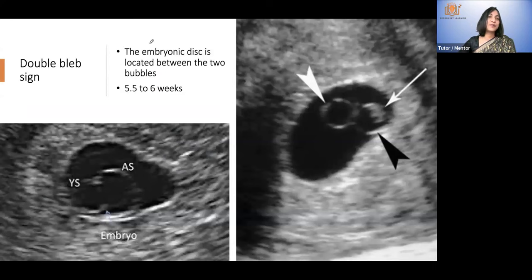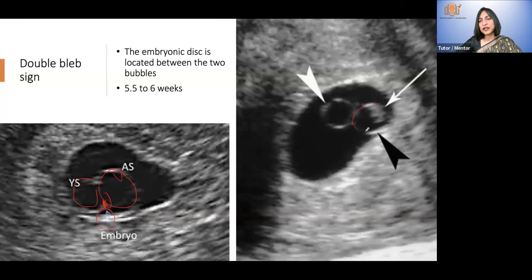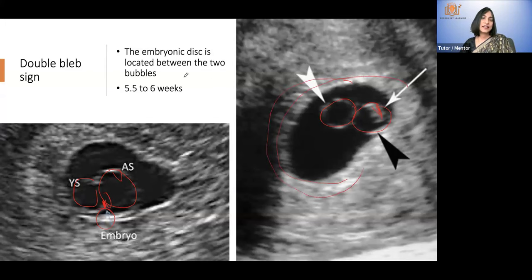What I want you to see is this double bleb sign. This is the yolk sac which appeared earlier and is still present, and there is an amniotic sac also. In this picture you see a small embryo — the embryo will not be present in the yolk sac; it has to be in the amniotic sac. In another clear picture: this is the amniotic sac, this is the yolk sac, and this is the embryo. That is the double bleb sign.